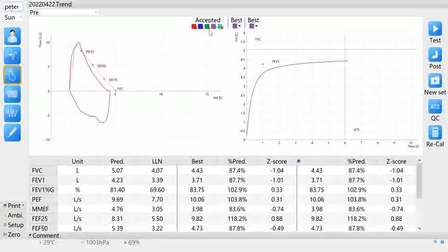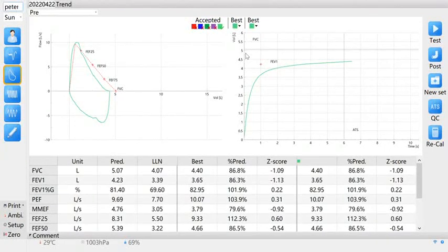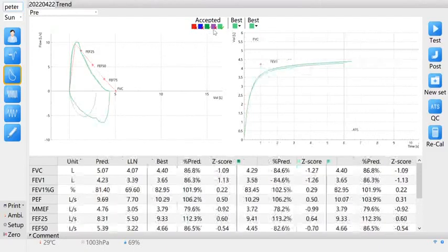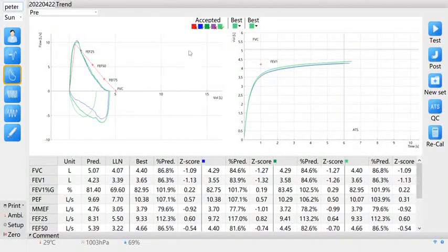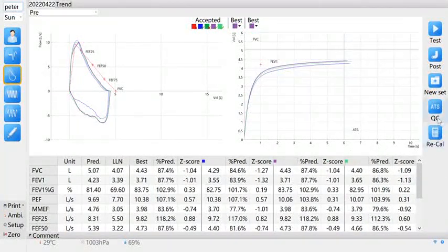Select the desired results. The best on the left indicates the best part of exhalation, and the best on the right indicates the best part of inhalation. It can be selected by the system or customized. After selecting the results, distinguish them with different colors. Check the best results. Analyze the corresponding data of the percentage predicted value. Click Quality Control on the right to check that the current quality grade or results meet the requirements. End of test. It can be tested up to 8 times until the results meet the requirements.